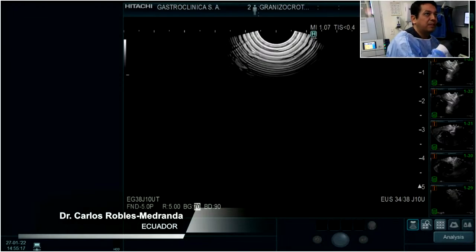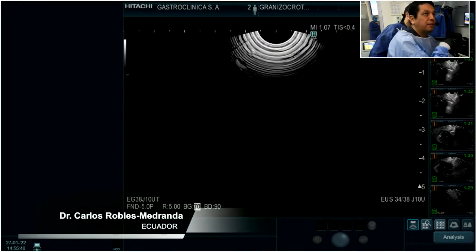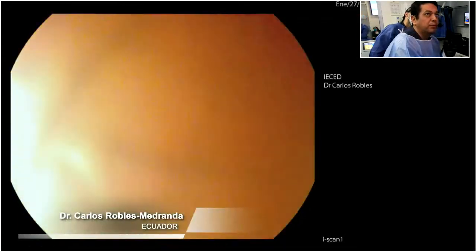You can see here. And you see here, this is a lot of, you can hold me here. So I will try to go inside. Oh, it's not easier, but it's not impossible.